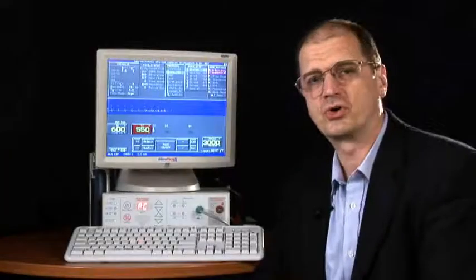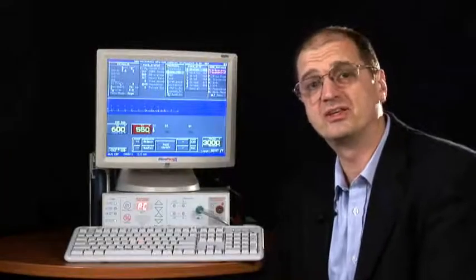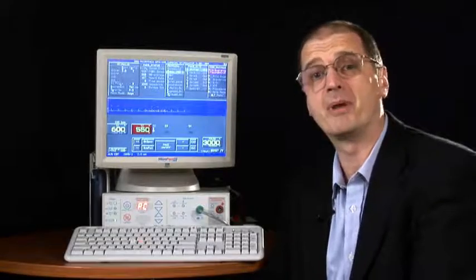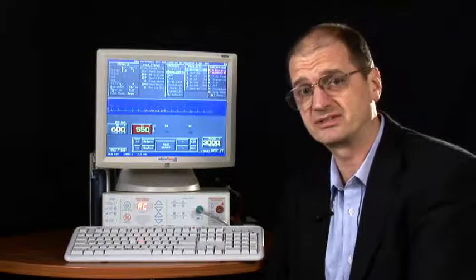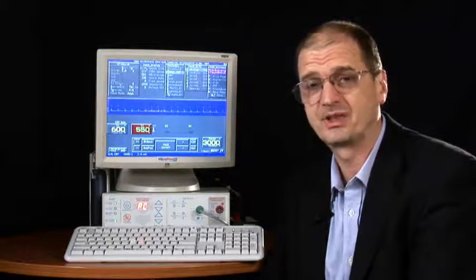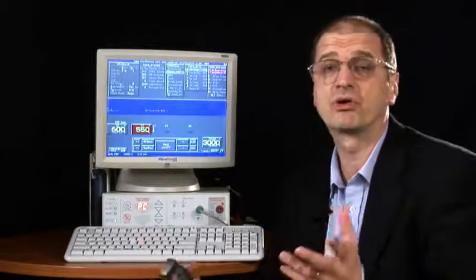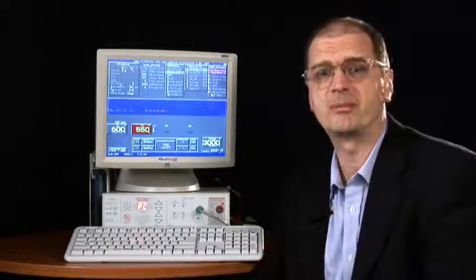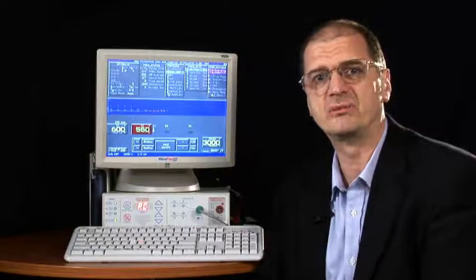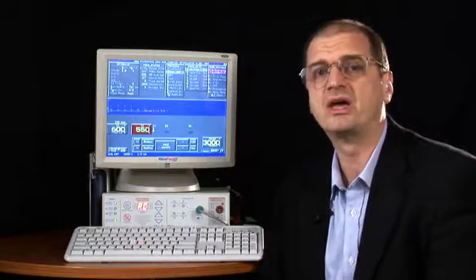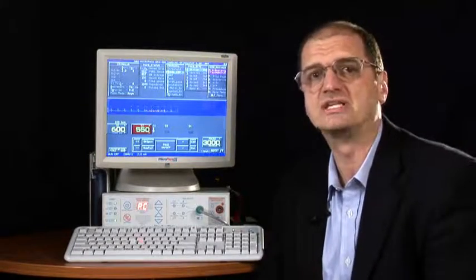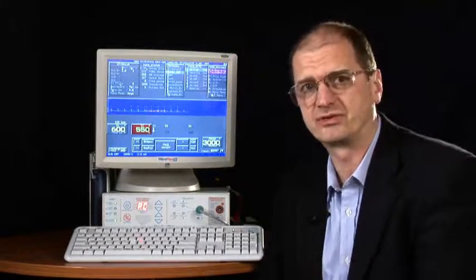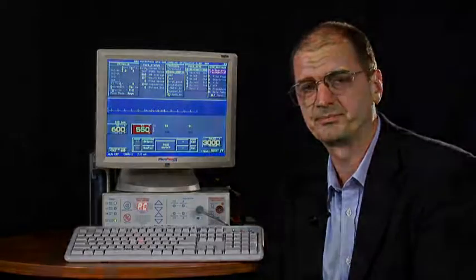Welcome to the tutorial on the basic use of the Micropace EPS320 cardiac stimulator. This tutorial will assume some basic knowledge of EP theory, because we cannot go into details of electrophysiology.